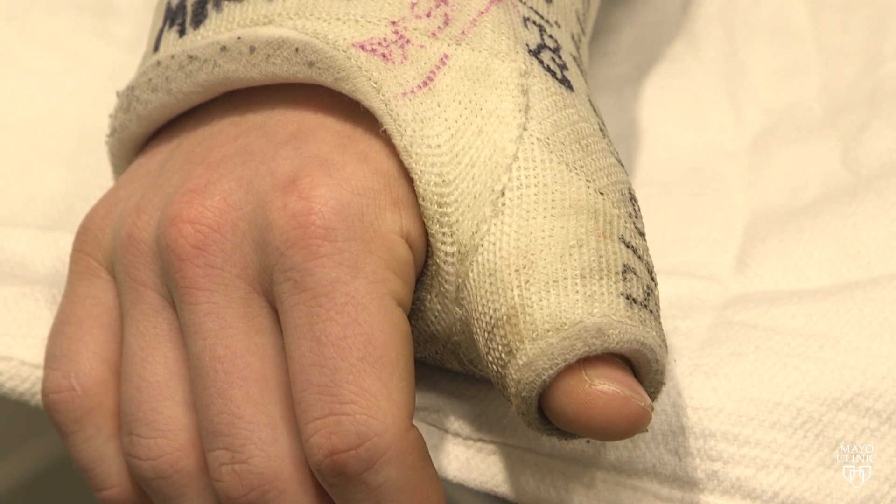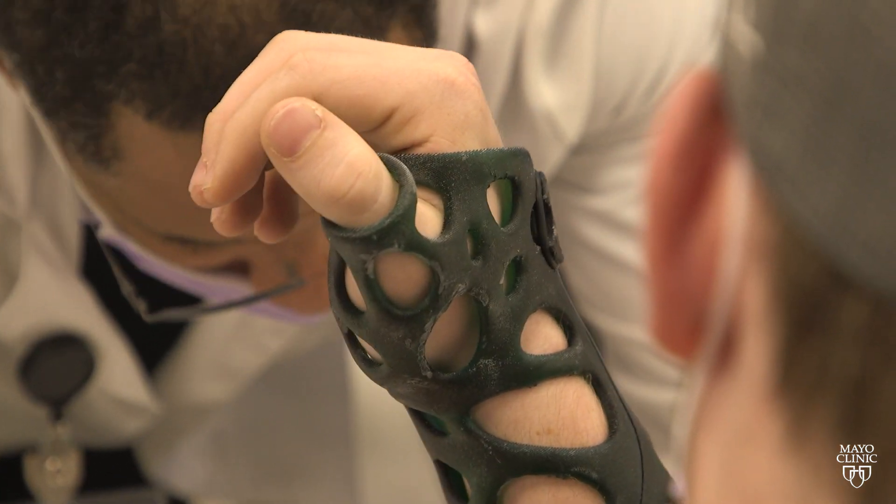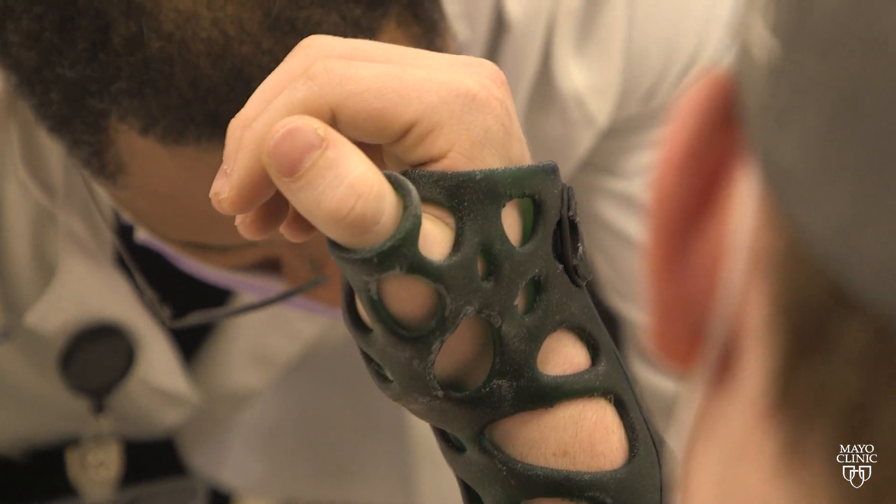Unlike a fiberglass cast, which transmits the force of impact to the bone, the polymer material used in a 3D printed cast disperses force evenly across the surface.